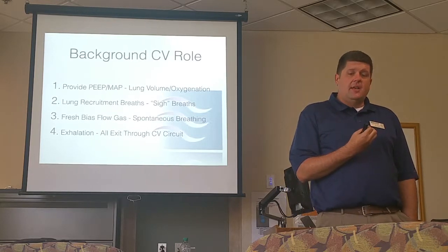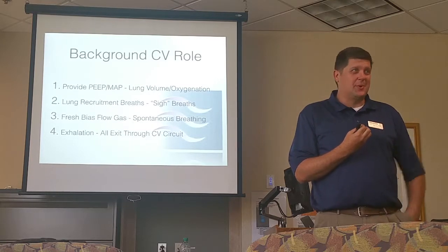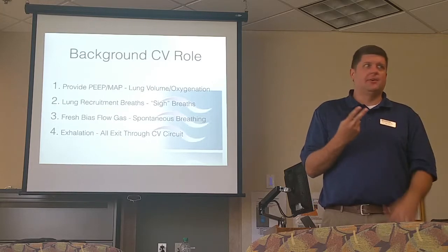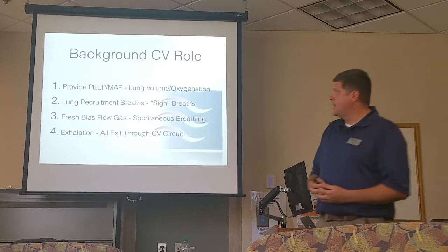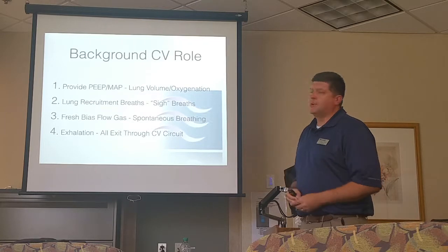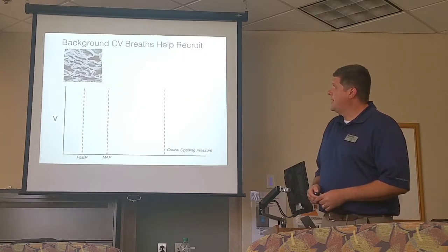You know, the jet is a very selfish machine. It only puts in enough gas flow to reach its own PIP, and that's it. And we're only talking a liter, maybe 2 liters a minute. So obviously the baby needs his own fresh supply for his spontaneous breaths. And that also comes from the conventional ventilator. All the exhaled gas goes out through the conventional circuit. So a conventional ventilator does quite a bit.